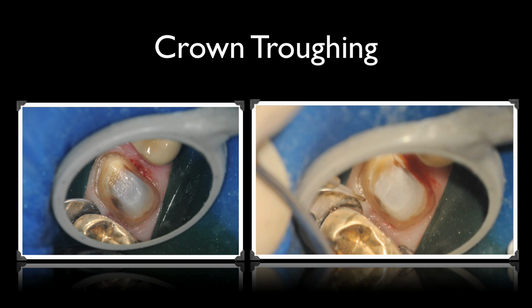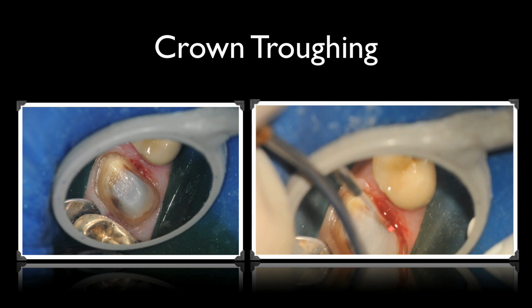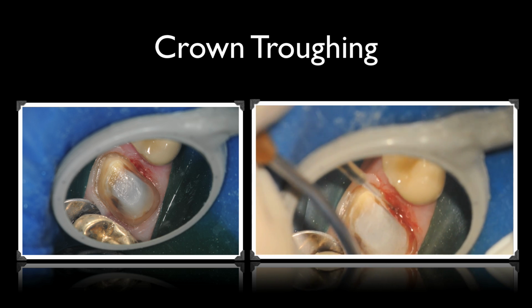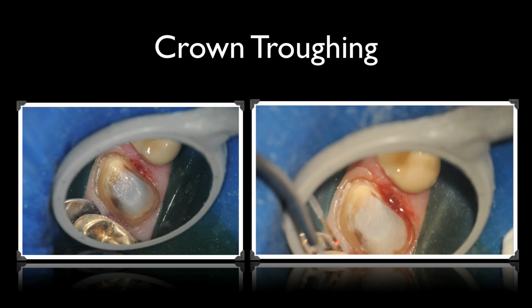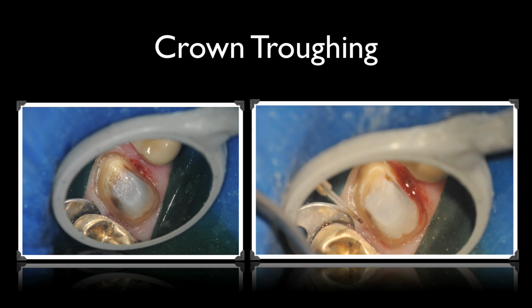You can see a fairly nice looking tissue, which with the low settings that I used is not going to cause you a lot of charring. It may take you a little longer to complete the process, but to me the speed is not the issue. It's doing a good job, and secondly, not creating a lot of postoperative sensitivity or recession.